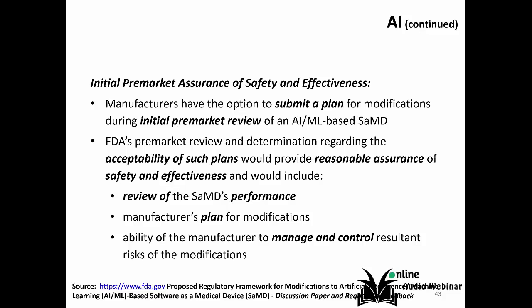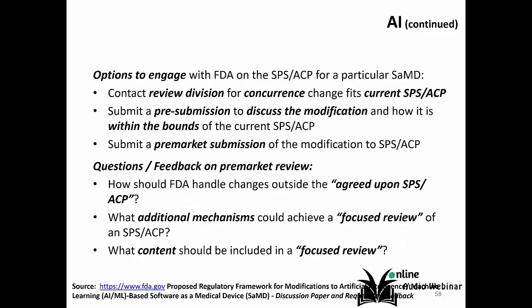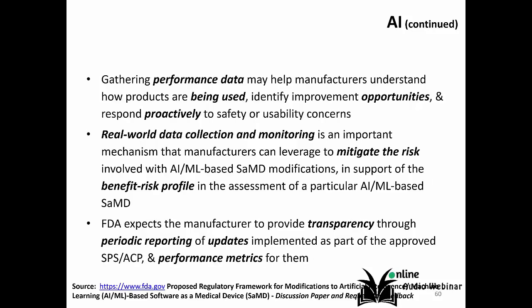Manufacturers have an option to submit a plan for how they're going to modify the AI/ML-based software. There's an option to engage with FDA on the SPS and ACP for a particular software product. Gathering the performance data can help the manufacturer understand how users are actually using the devices.